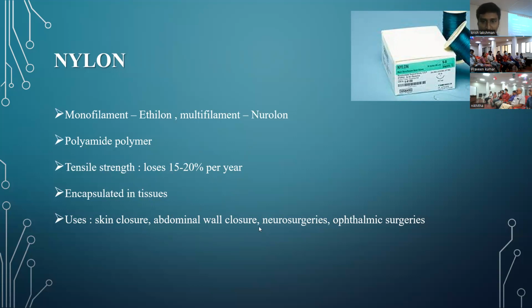What does encapsulated in tissues mean? Basically, if you leave the suture in place for a long period of time, the surrounding tissues will go on covering it. So the suture might get buried under it. So don't leave skin suture for a very long period of time, assuming it's going to give you better strength. You will actually have difficulty in suture removal at that point.